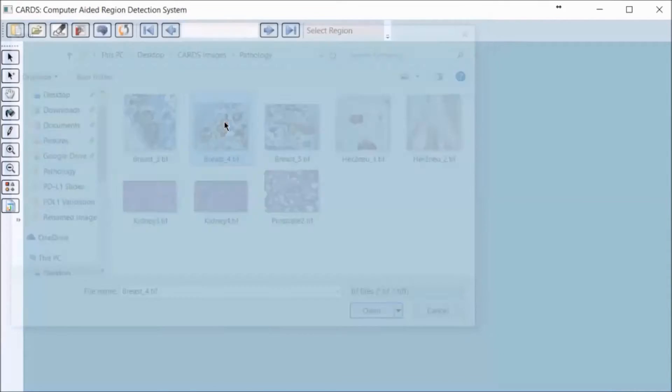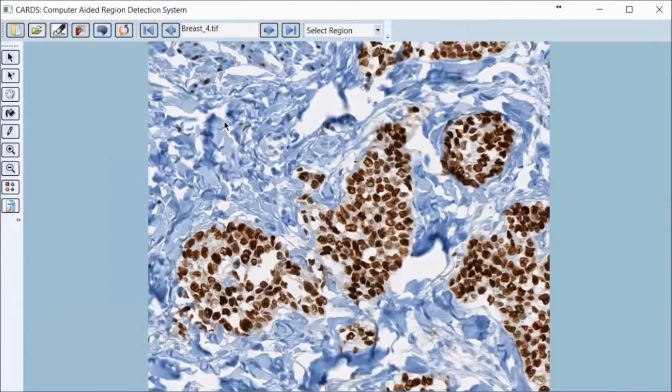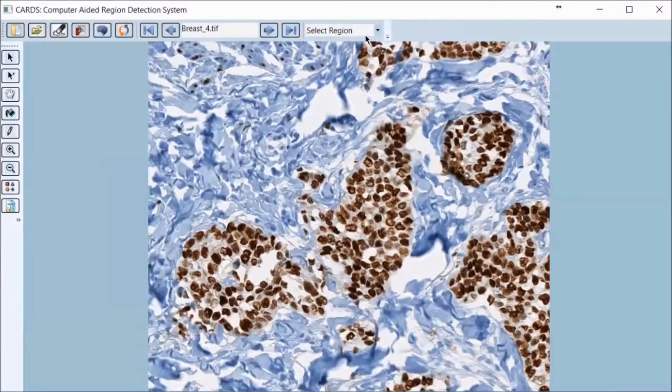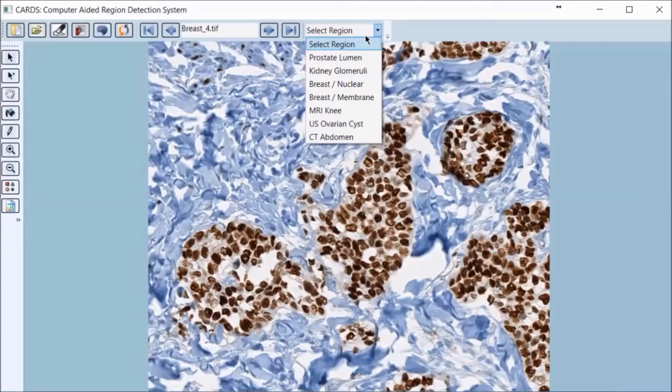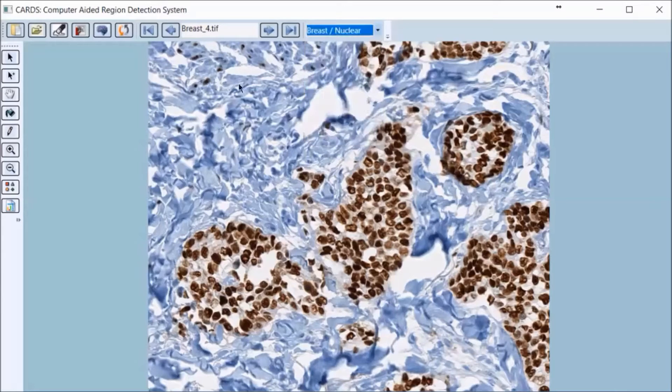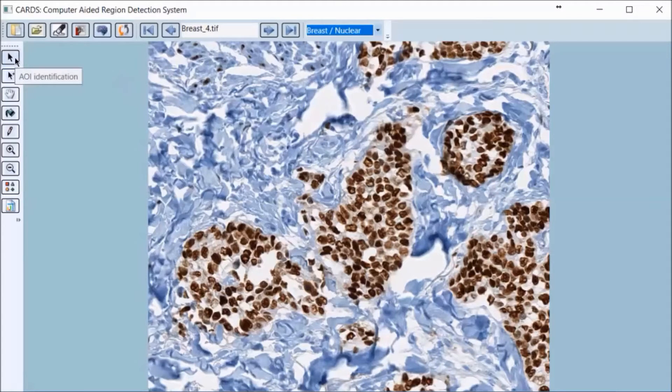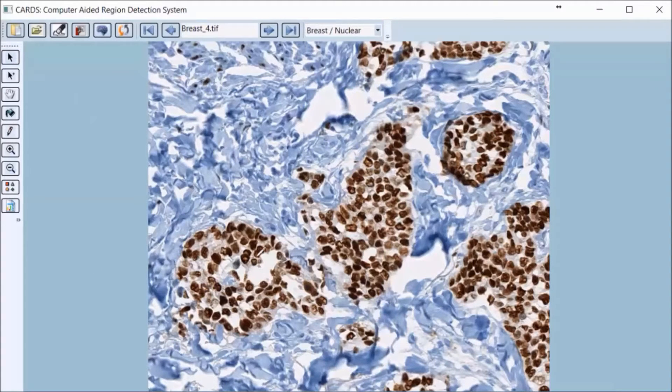Here we have a breast tumor image for which we can select its corresponding algorithm. Using our area of interest detection tool, a user can simply click on a tumorous region to automatically highlight it.